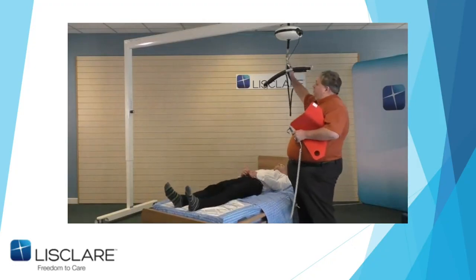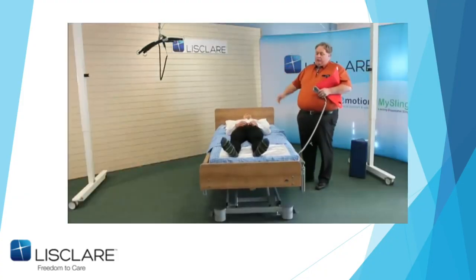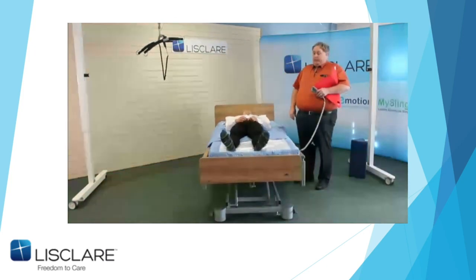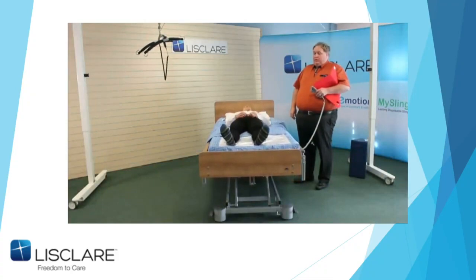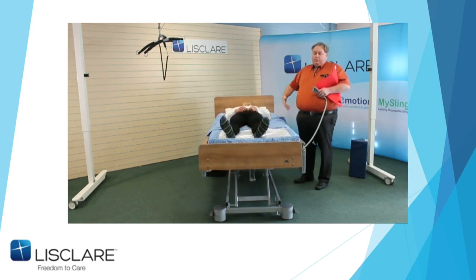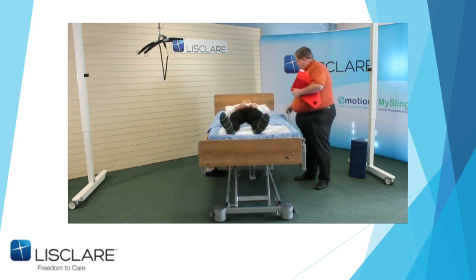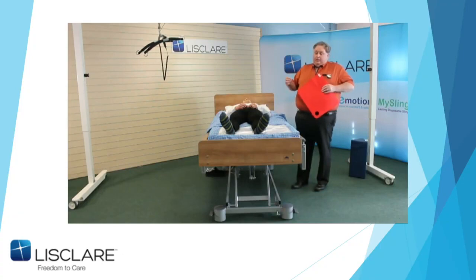Now, as I said, the beauty about the Regalia bed, it drops down low and comes up high. Now, John, like a good lad, has actually got down the bed a bit low. All right? So I'm going to show you a couple of ways of getting John back up the bed first, and then I'm going to actually describe the next stage and why we do things. Okay? Again, we've done this quite a few times. So I'm going to start off with bring John back up the bed, because I might as well, and then try and stop him going down the bed.